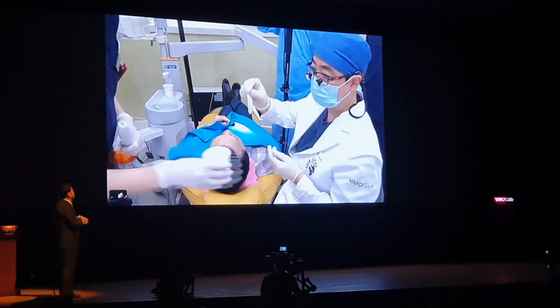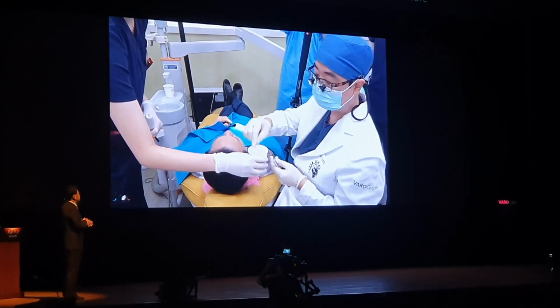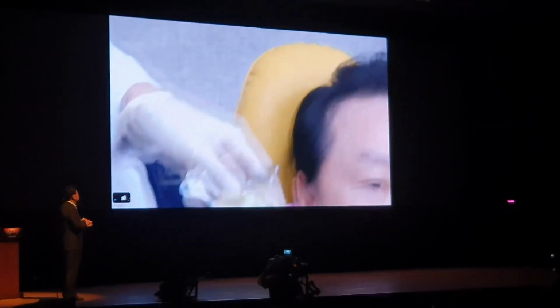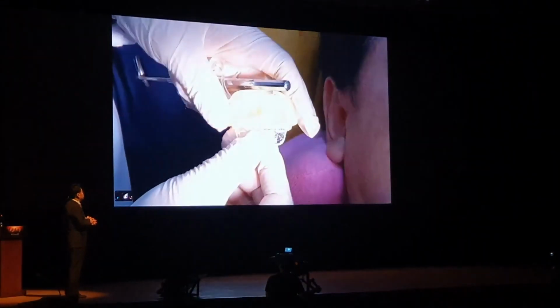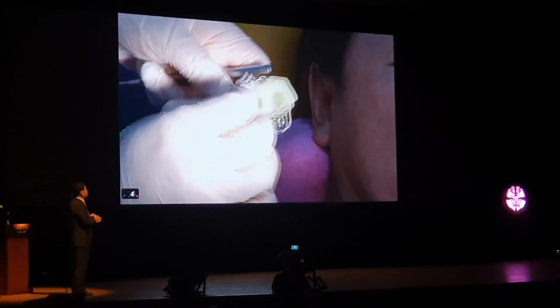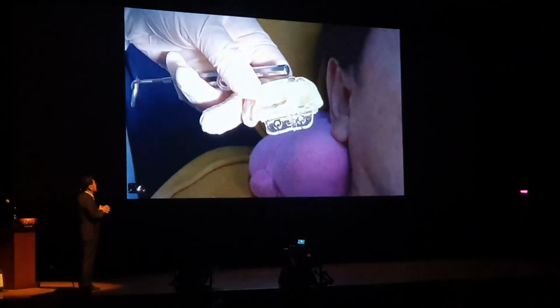I'm going to cool it once more. Now I'm going to remove the clip that was there to protect the jig. Removed. Next, I'm removing the thin plastic tape layers over here. I think it's a thin layer that prevents the resin from entering the undercuts of the indexing.